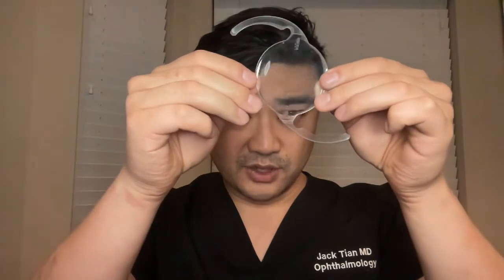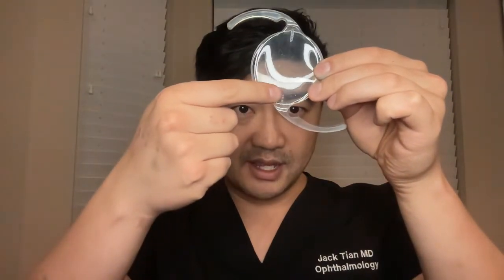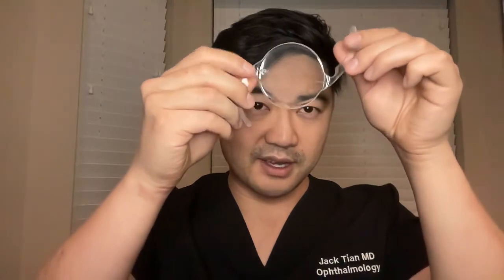Here is a toric lens. You can see that it has markings here and here. And the way this works is we dial it into the right axis to neutralize your astigmatism inside the eye. The arms of the intraocular lens will scar into the tissue and this will hold the lens into place.